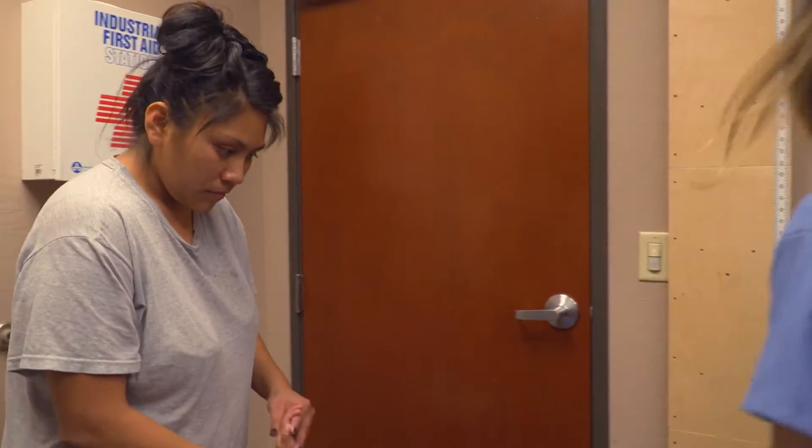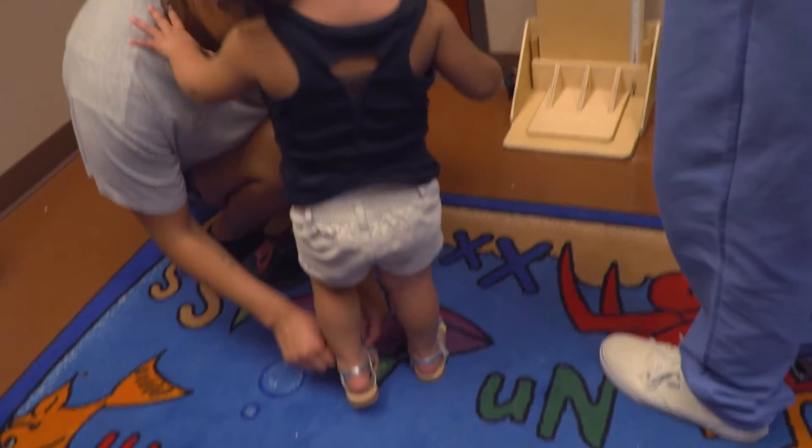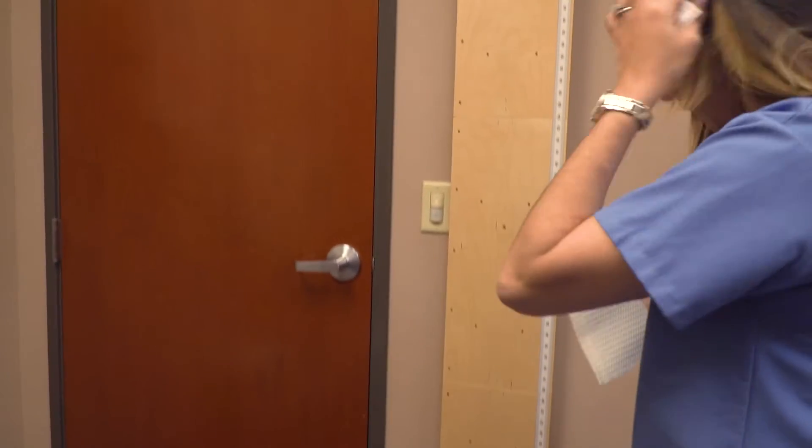So now we're going to go ahead and get her weight and height. Can we actually have you take her shoes off? Okay. And does she wear a diaper? Yeah, she does. Does she have a dry diaper on? Yeah, she does.